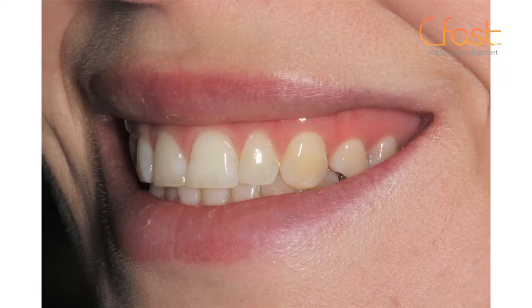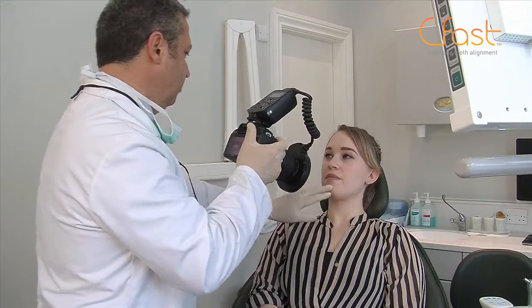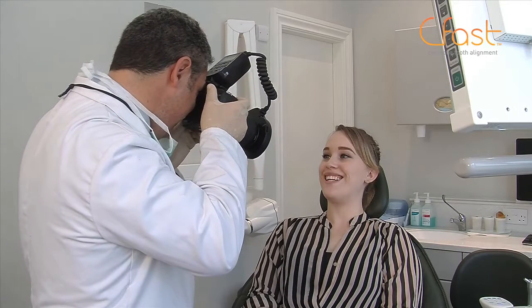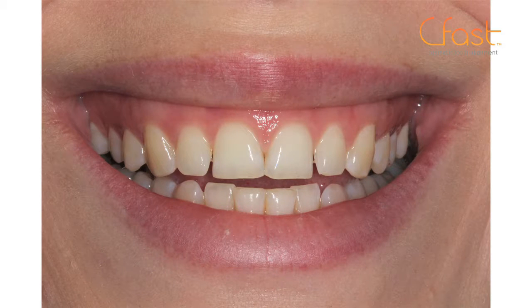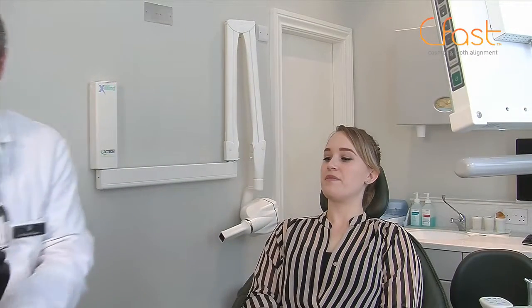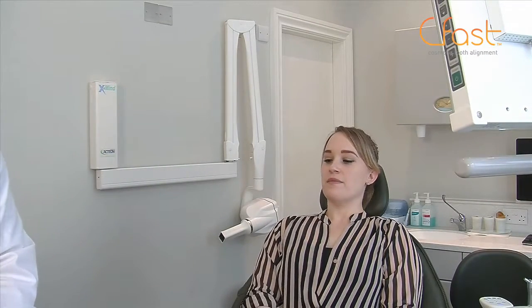So, those are our extraoral views, okay? And just one more, say E for me now, please. E, big wide E. There we are. Okay, those are our extraoral shots, okay? So now, we're going to take our intraoral shots.